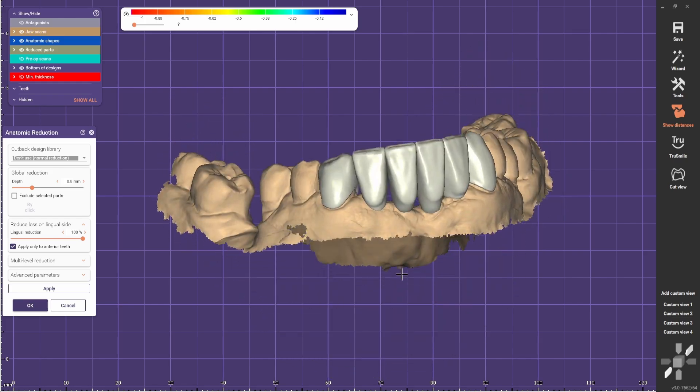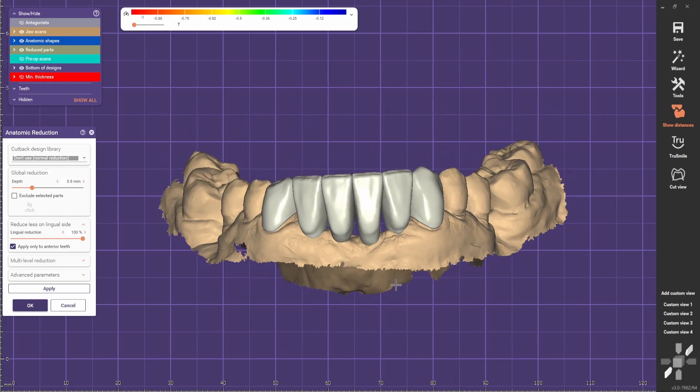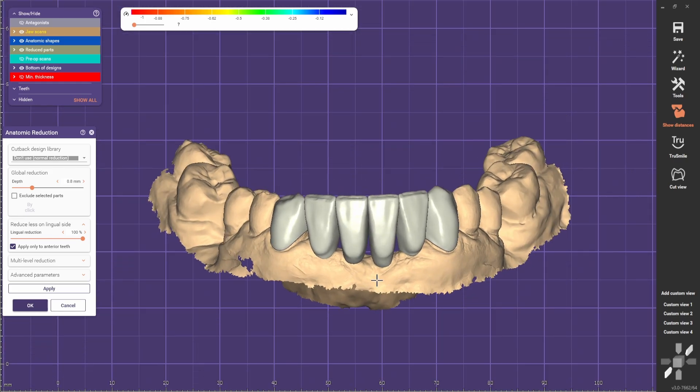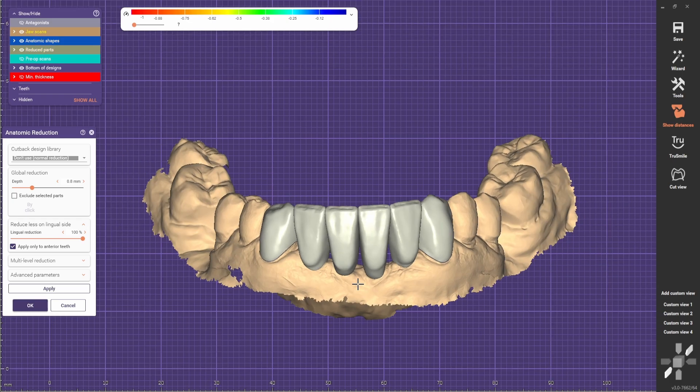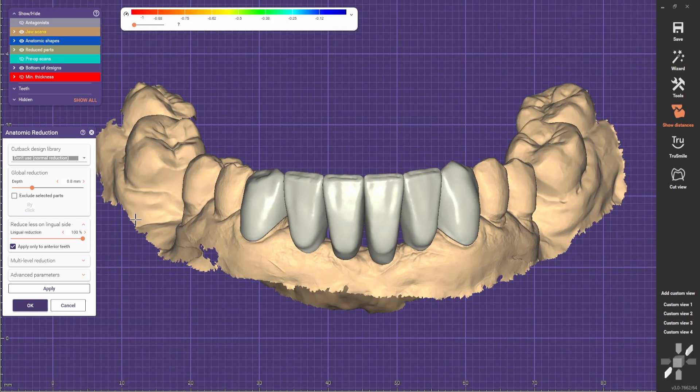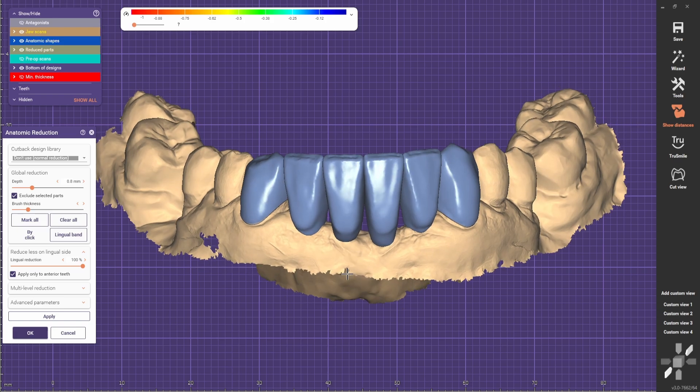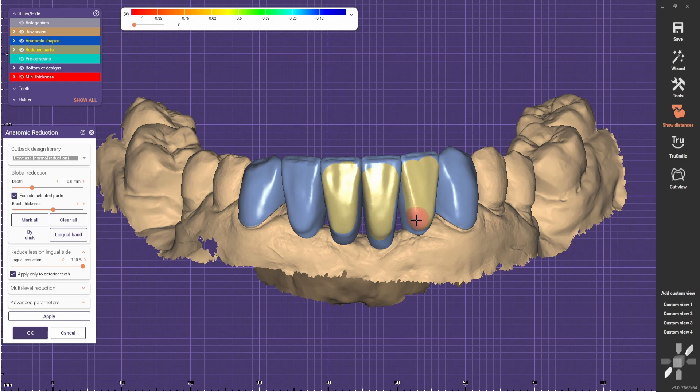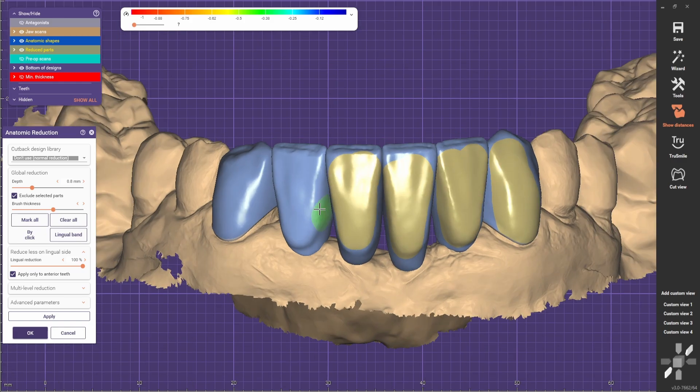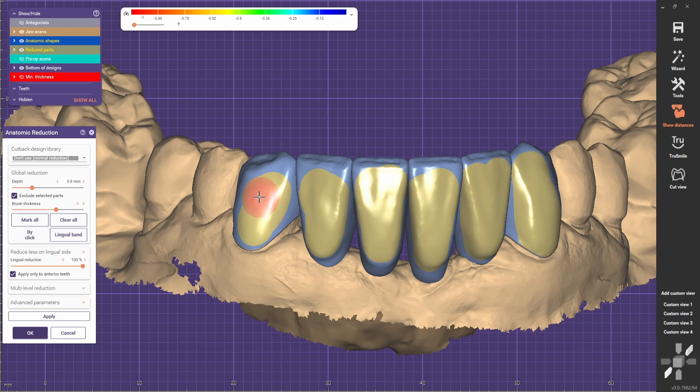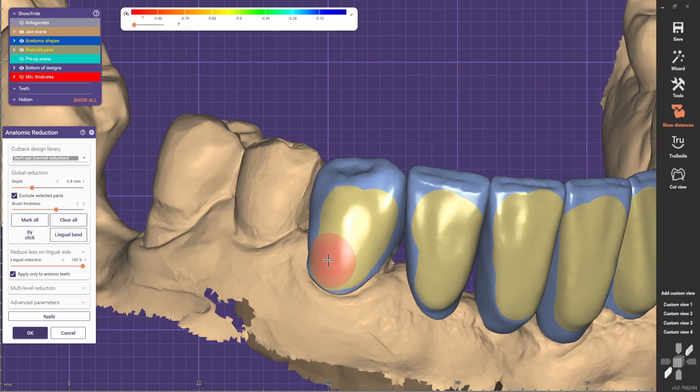Hello guys, welcome back. In the other video we designed this bridge, and now I'm going to do the reduction for that. We go exclude selected parts, mark all, and then we paint the areas that we want to make reduced. What's in yellow is going to be reduced, and what's in blue is going to be full contour.